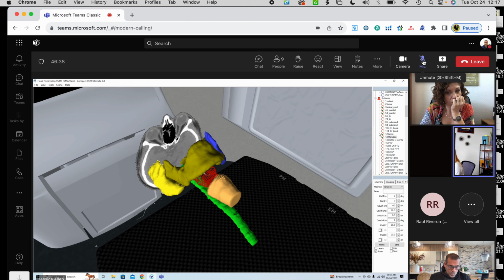I think what I have pulled up right now, just so you realize, the reason it doesn't have the brain structures is because I have a head and neck pulled up. I think we're treating probably a larynx for this case. We can see the parotid, we can see the mandible, and the part of the mandible they are testing you on is the ramus of the mandible.